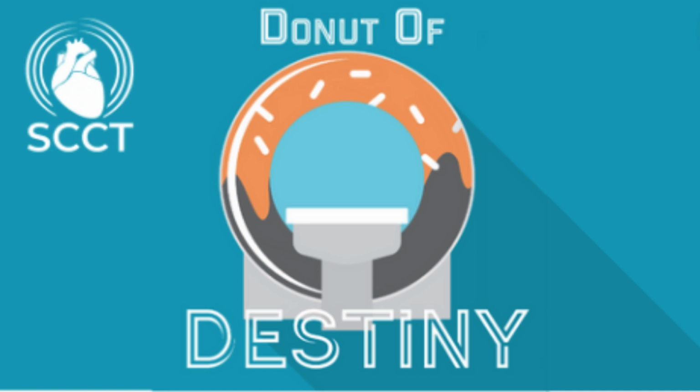For diastole, I personally don't have much experience. I think over there people still use percents, and so I cannot come up with a number for where exactly the diastasis will be, but I know it changes with heart rate.